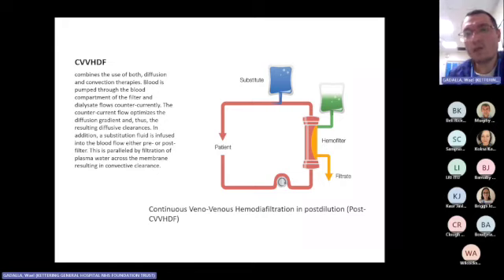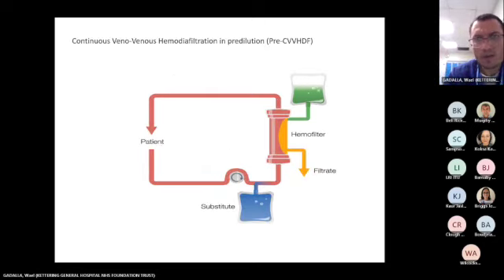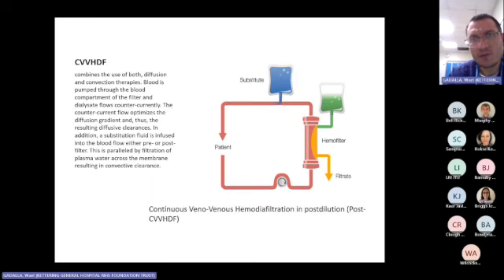And this is how it looks like. So you have here the dialysate, and you have also the substitute. Substitute can be pre or post filter. So this is when we use the substitute pre the filter, and this is when we use post filter.